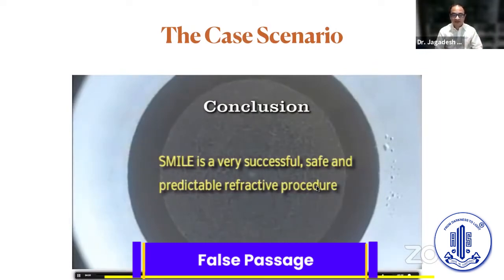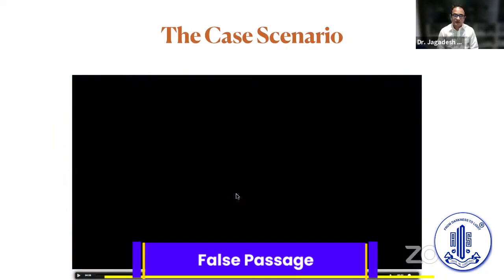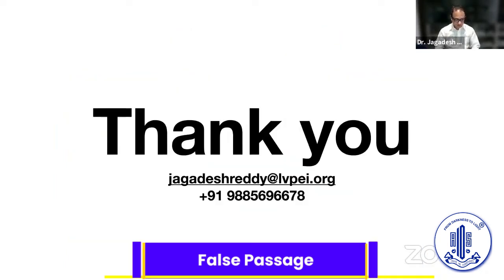So I would say SMILE is a very successful, safe and predictable refractive procedure once you understand every step involved in this procedure. So that's what I had, Deepthi, for this case. I think Dr. Rupal can add more to this.